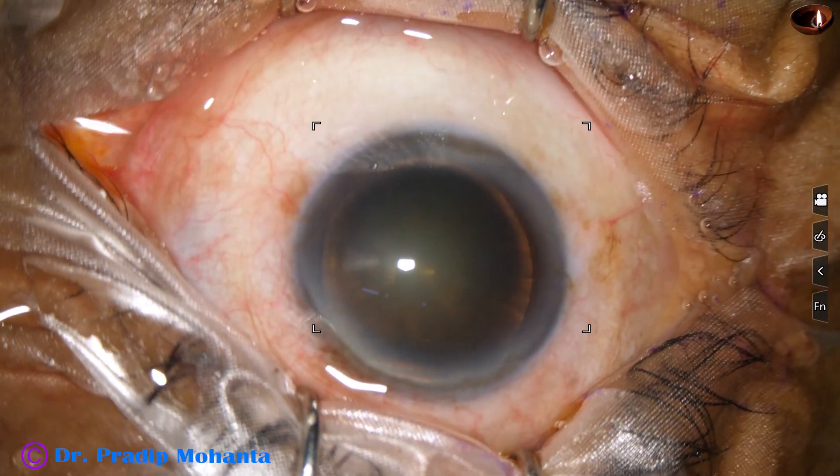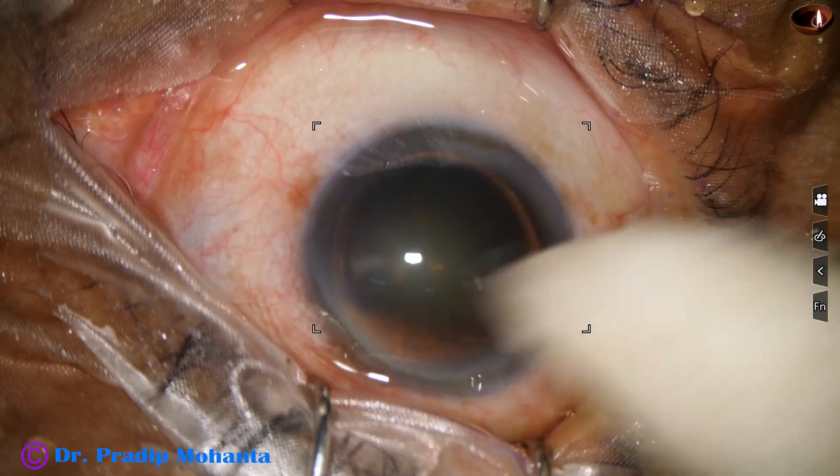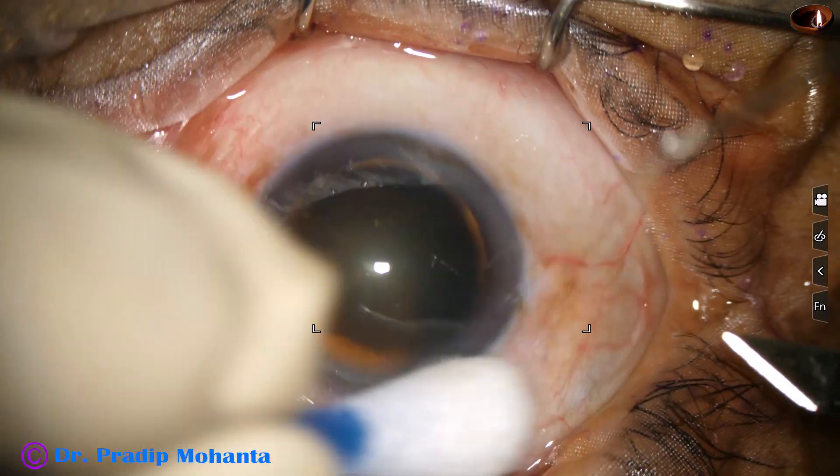After instilling few drops of povidone iodine over the ocular surface, the ocular surface is thoroughly irrigated by Ringer's lactate or BSS.